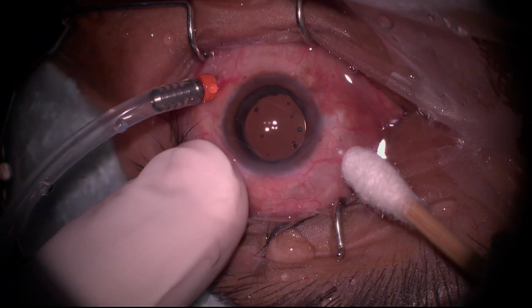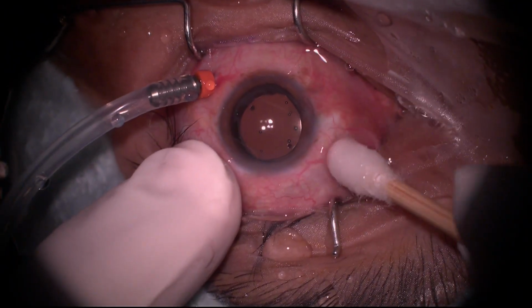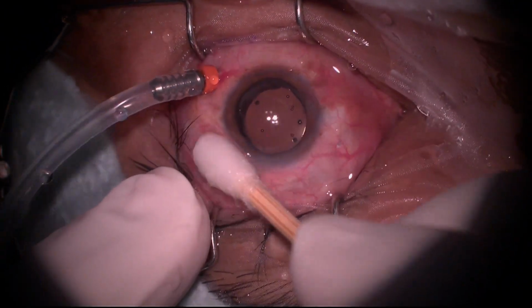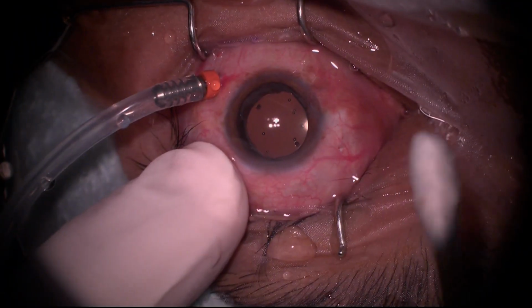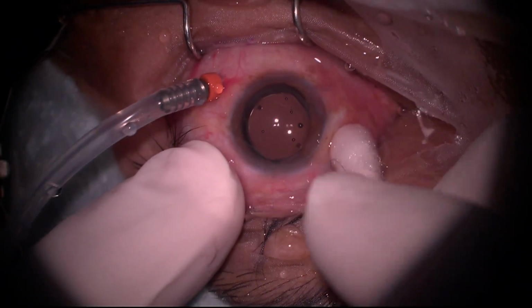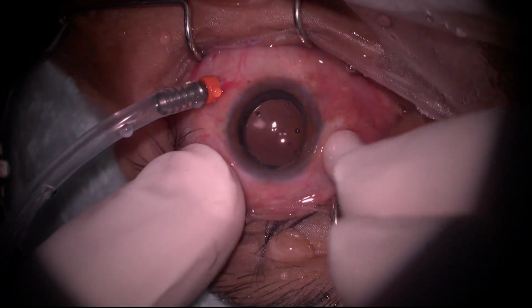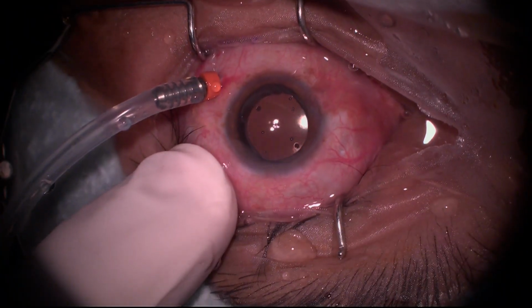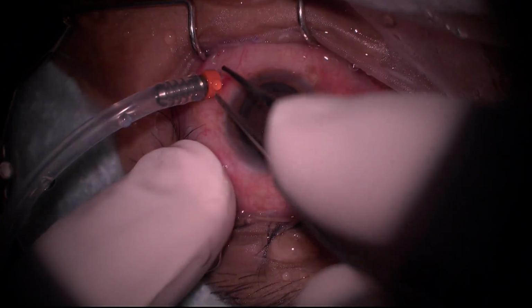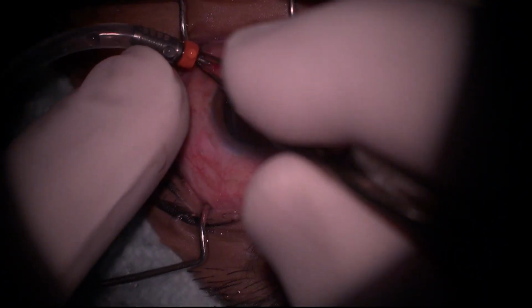Whatever you do, your sclerostomies have their mind of their own. They will leak if they want to leak. They will not leak if they don't want to leak. You don't have any control over them. Now, nobody answered my question that is this a pterygium or a pseudopterygium? Chopstick.